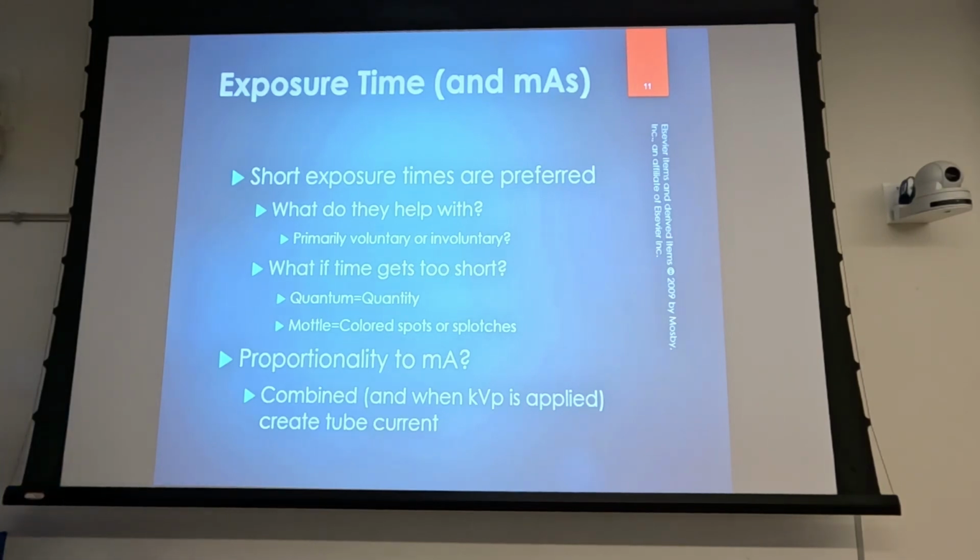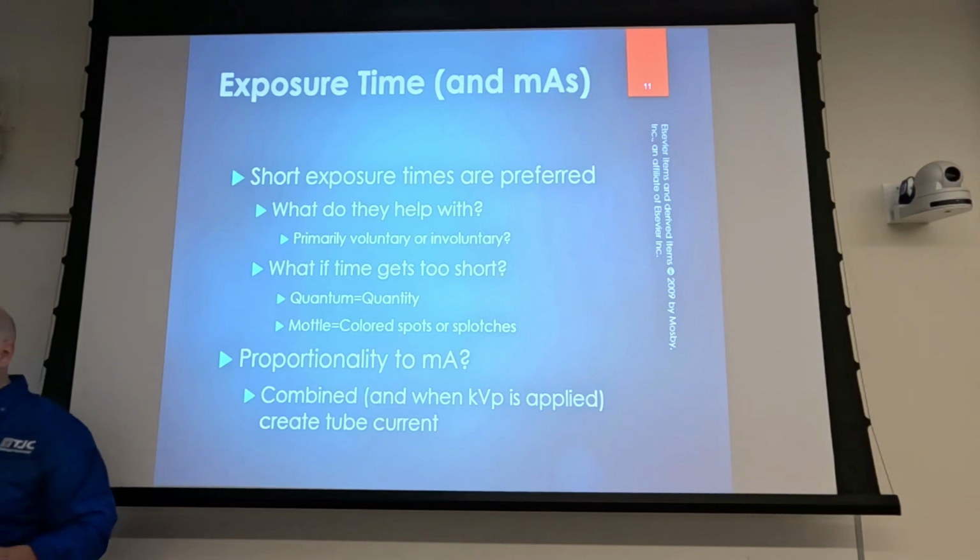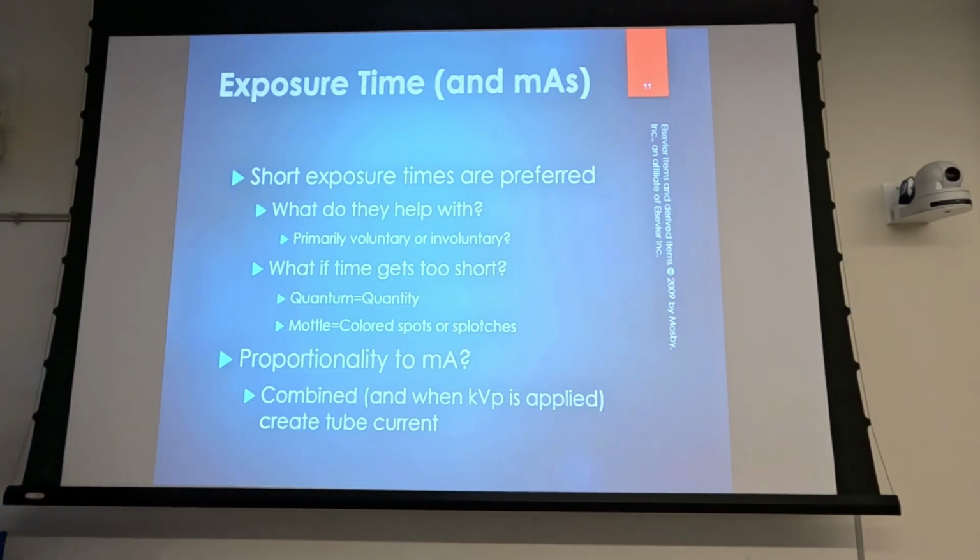And again, this is not as much of a problem with our current image receptors as what it was in the past. Your screens and films, for example, they needed a little bit of time to make the exposure. I tried to make this point, well, not really this point, but X-ray film is kind of like photographic film, which y'all have no real exposure to either, but it's sensitive to light. Okay, so I was trying to make the point when we were over in Pirtle. We had these screens that would put an X-ray film in and would make an exposure, and we had to take the film out and put it in a processor.